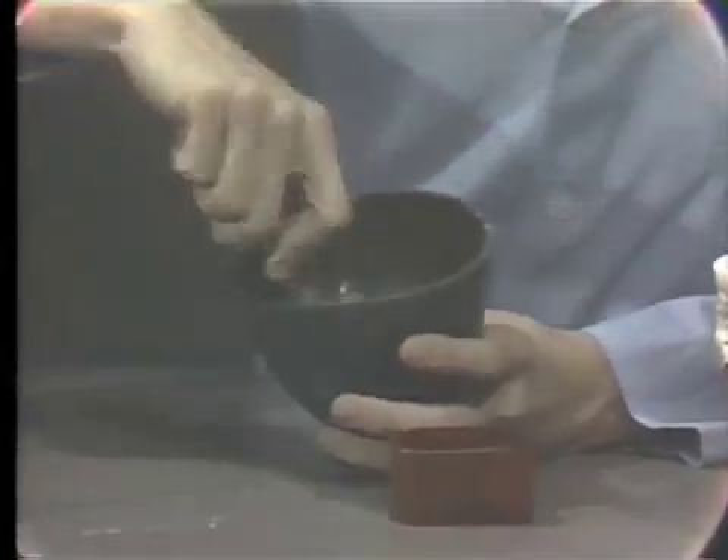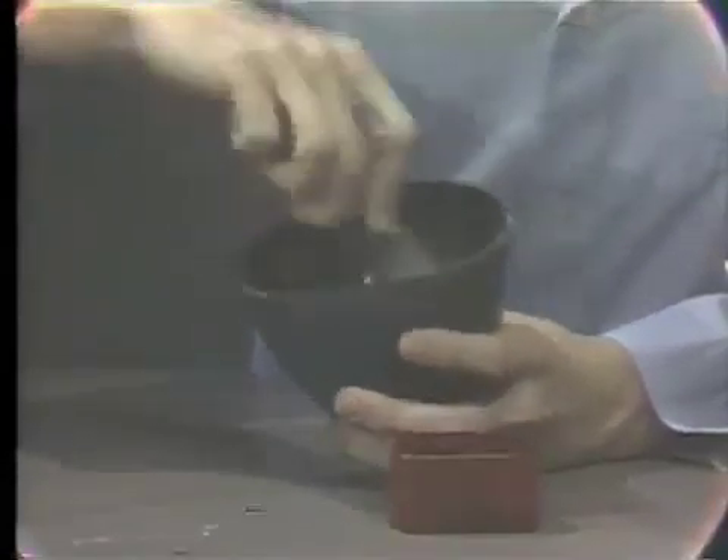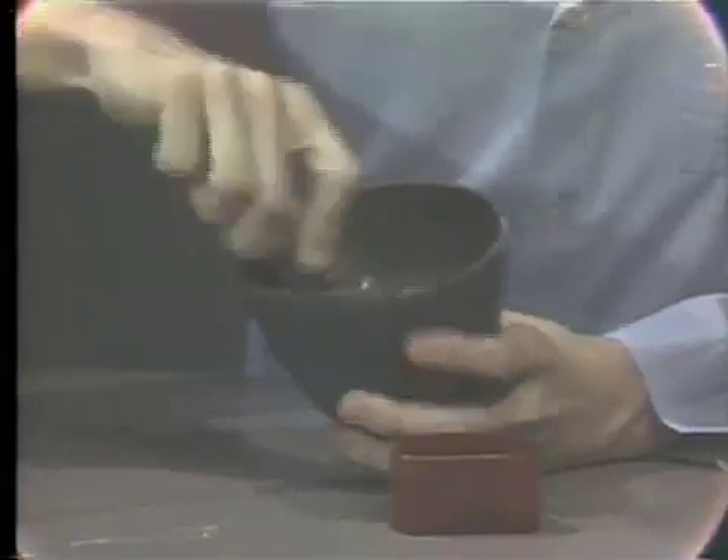We are going to mix this here to a nice smooth consistency, and then just prior to pouring the boxed impression, we will vibrate the stone on the vibrator.